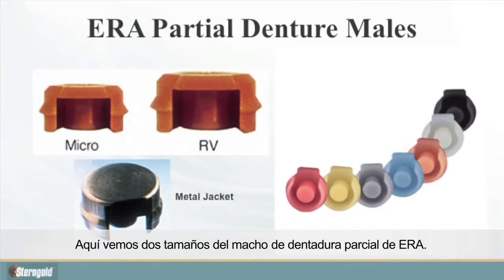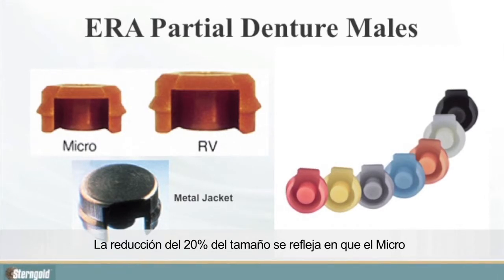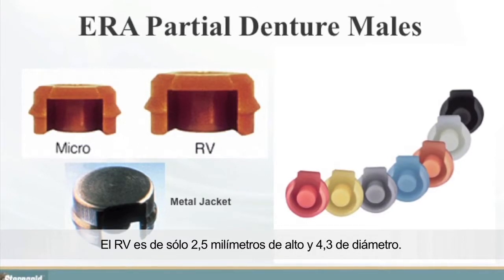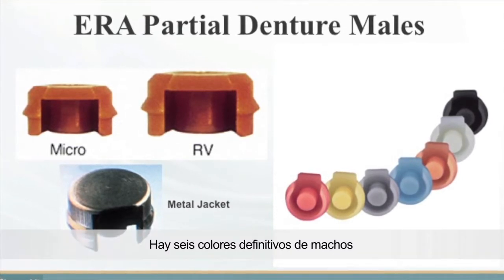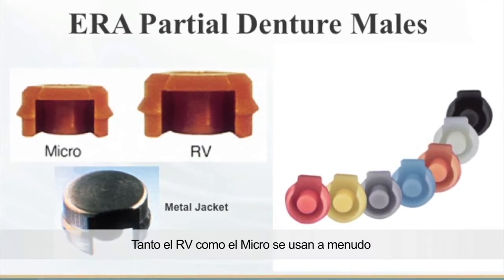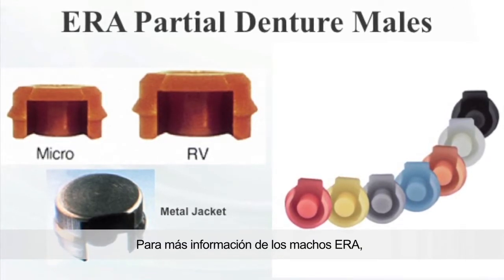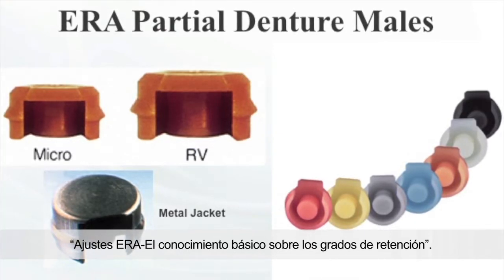Here we see 2 sizes of ERA partial denture male. The 20% reduction in size translates to the micro being only 2 millimeters tall and 3.4 millimeters wide. The RV is 2.5 millimeters tall and 4.3 millimeters in diameter. There are 6 colored final males and a black processing male in each size. Both the RV and the micros are most often used as the ERA metal jacket. For more information on the ERA males, please view our video titled ERA Male Attachment: The Basic Understanding of the Levels of Retention.